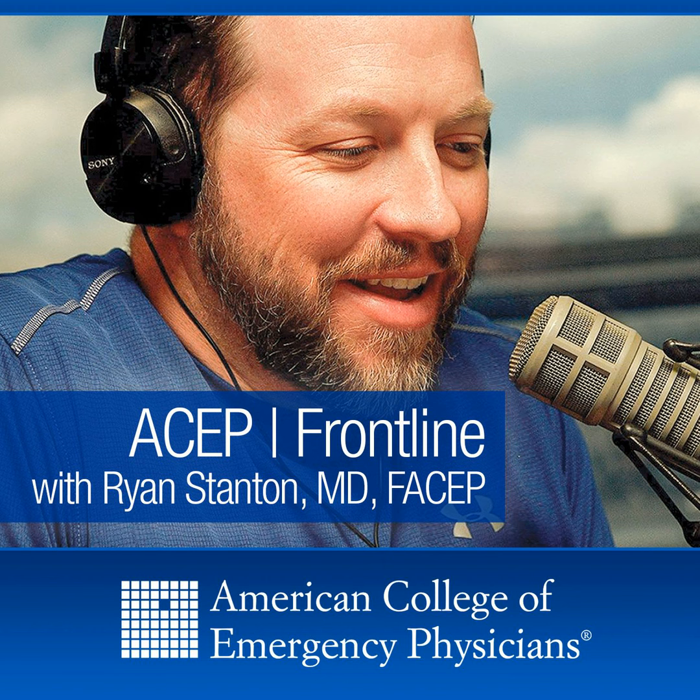Mm-hmm. In our lab specifically, we will mimic hands on someone's chest like they're doing compressions, so that people can get used to snaking their probe in between providers' hands. We're going to practice some left-handed scanning, because that may be helpful to you when you're monitoring a code. And we're just going to have discussions about pathologies, with examples, and specifically the PEA, pseudo-PEA arena, what that actually looks like on an ultrasound clip.